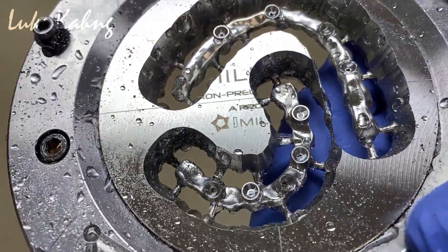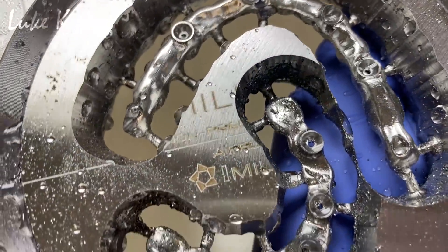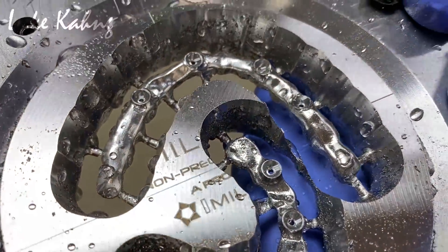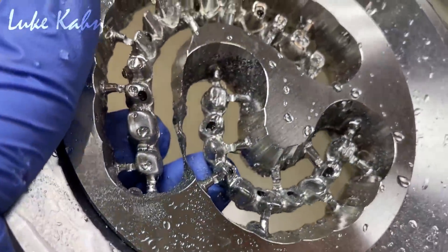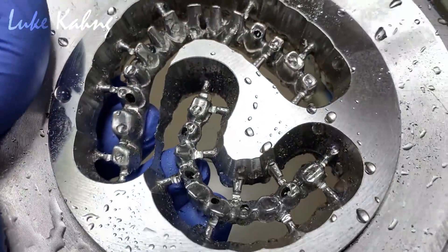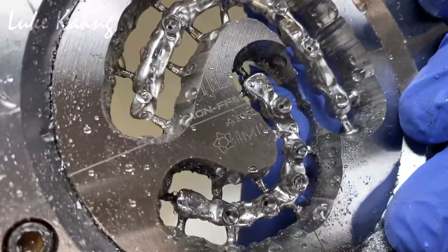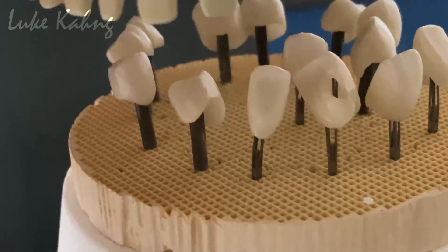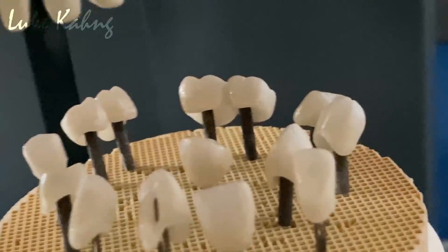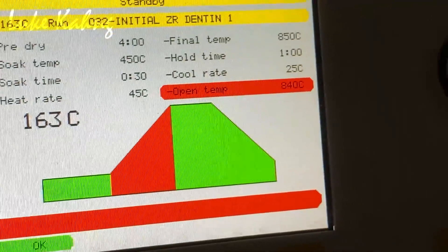Now we're ready to start milling — nice design, good job. This is another Saiton 7 Star, which is great. Long span underneath pontic — 4 implants on this one, 5 implants on the other one. Especially the back tooth, it's very small. So now this was rolled and then cut, and then we put some opaque. This is Saiton 7 Stars cases after the first bake — individual two-unit. Now it's ready to take out.